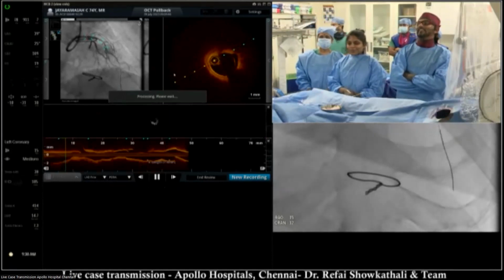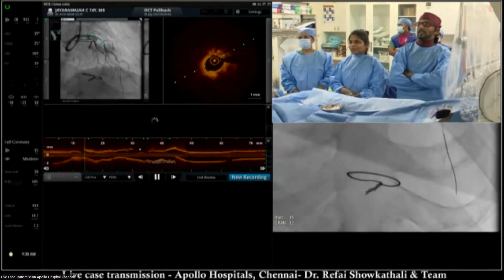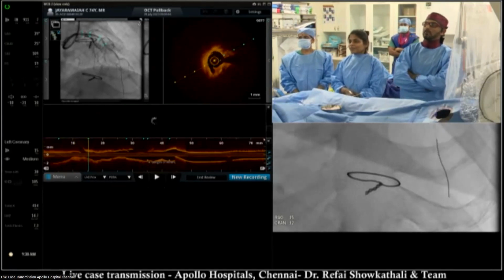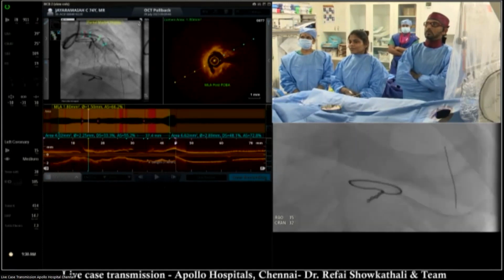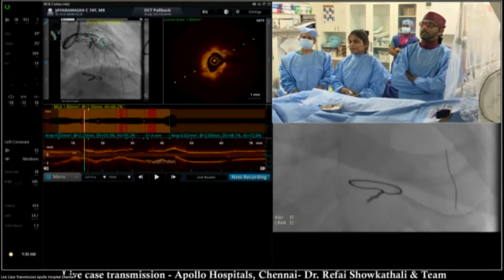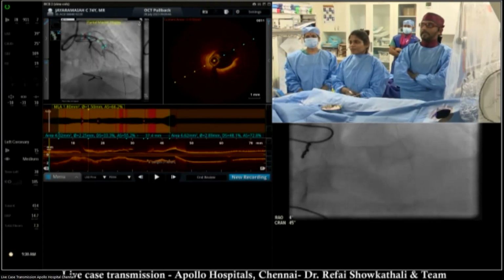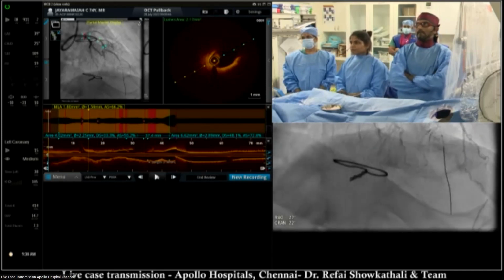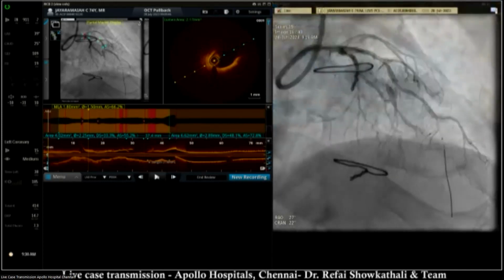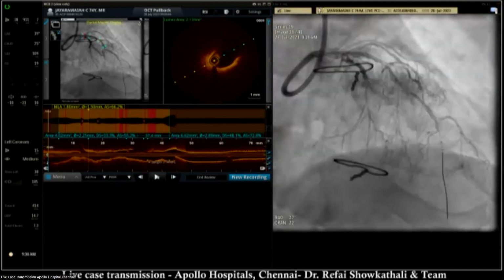Okay, good. Sorry, so the decision was where to stop my distal edge of the stent. I think we have a decent space of around 2.75, which I'll show in the next OCT after ballooning. So I used a 2.5 balloon to pre-dilate. You used an NC balloon in this case because your atherectomy is not required. You are not a strong believer of cutting balloon and scoring balloon. It's okay. So you just used an NC balloon and did one more OCT after that?